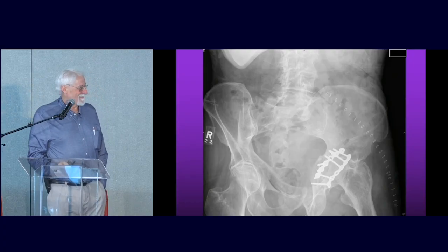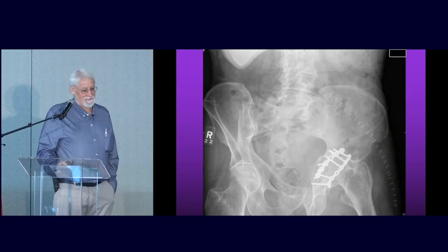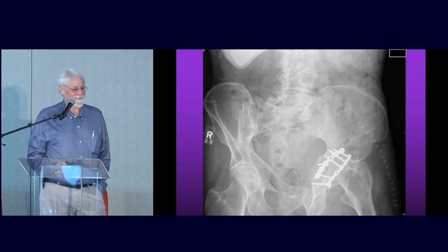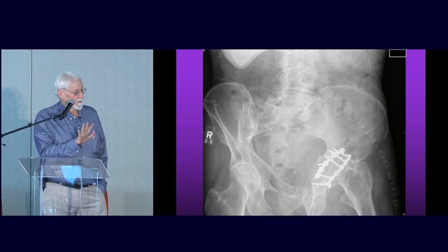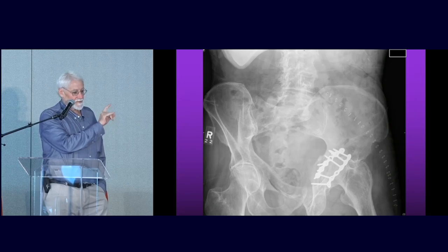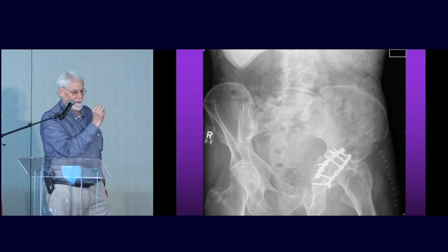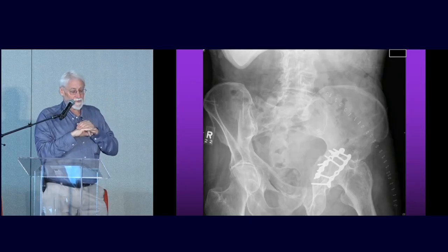How about if this patient showed up at Parkland with that injury, and they put a couple of cannulated screws, one down the anterior column, one down the posterior column, like the one I showed yesterday, done by Adam himself or Charlie Reiner? Then they talk about getting a secondary congruency. You would have never addressed the impaction, but you would have stabilized the columns with much smaller incisions. Yeah, so it's interesting. You have the same problem whether you put screws or plates on it, because you can't keep that head under the dome. Now, if you could keep it somehow, then potentially it would be different. But to me, it's the same problem.